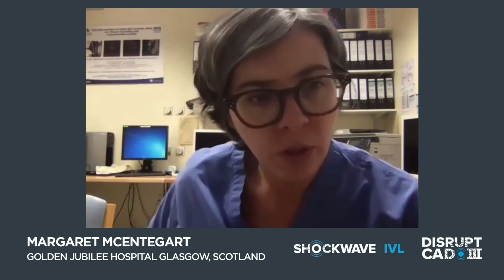Yeah, I think this is, for me, the most interesting question about IVL: how it affects the eccentric, particularly the nodular eccentric, because obviously you can have eccentric calcium that's within the plaque, within the circumference of the vessel, and then you can have this real protruding eccentric calcium into the lumen. I think the interesting question is, does it have the same effect on the big nodule as you would get from volume reduction with atherectomy?